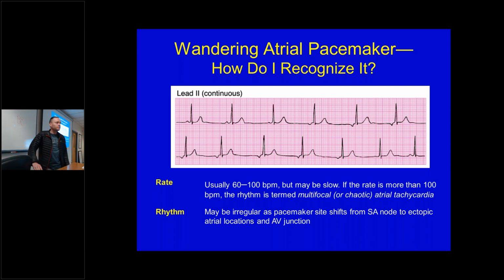So we're just seeing something firing. Or when it's normal, we've probably got an SA node, right? Maybe that might be an SA node. It's a little bit hard to say just because you don't have enough regular P waves to really decide which is the SA node. But that's probably the closest to the SA node. I mean, that could even be what their normal is. I just don't have enough of the strip to tell.